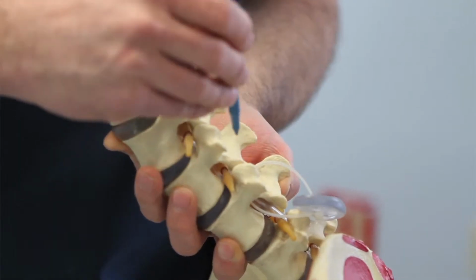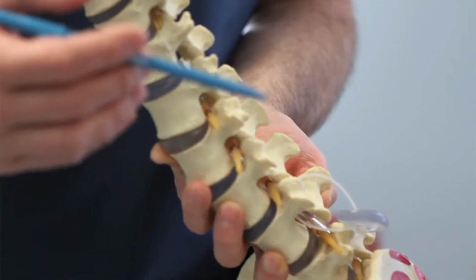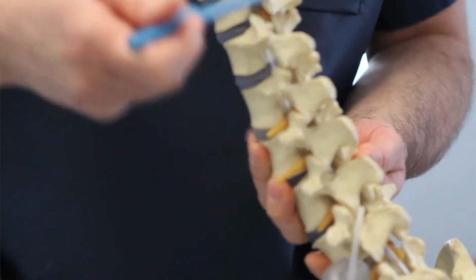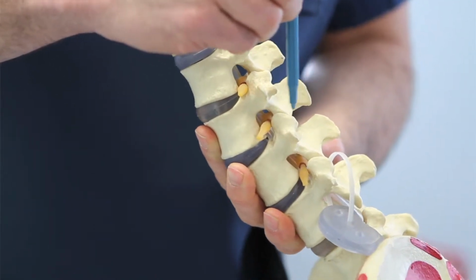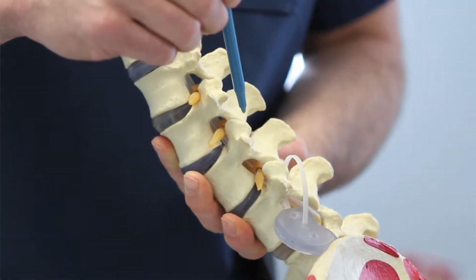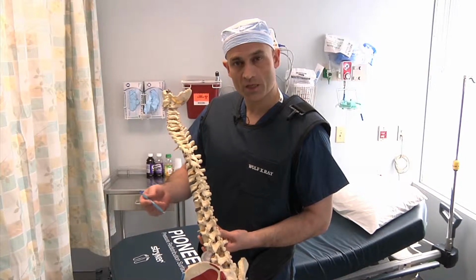A therapeutic solution is then injected through the needle into the joint, leading to some relief of the patient's back pain. This is the back of the spine. These are the spinous processes. These are the lumbar facet joints which provide stability and motion to the back of the spine. It is these joints that when degenerate can cause lower back pain.